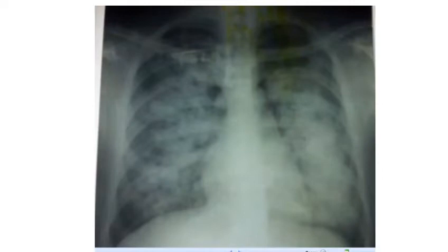What is this appearance due to? Significant PVH, stenosis, significant PVH, alveolar edema. Oh, you can say pulmonary edema. Why do you want to say alveolar edema? Yes. Alveoli, it indicates pulmonary edema.